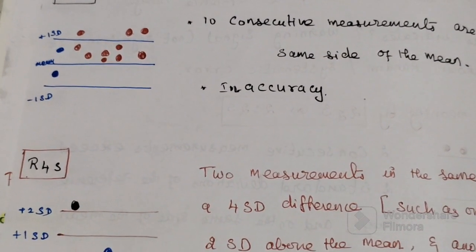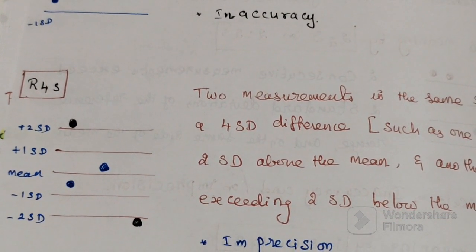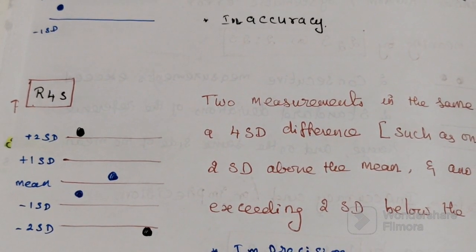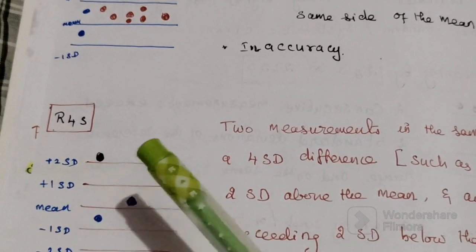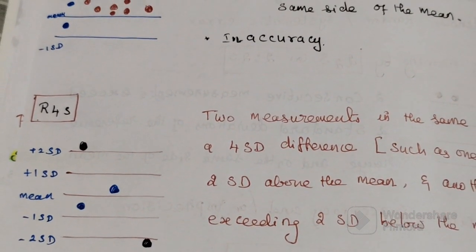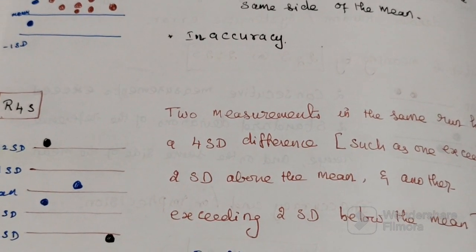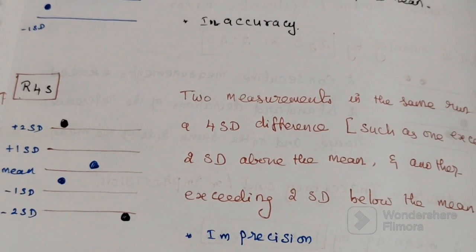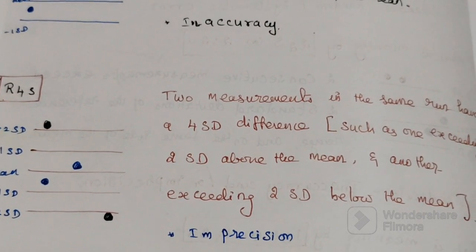Then the last one is the R4S rule. Here you can see that there are two levels of control. If one level of control is beyond 2 standard deviation, and the second level of control is also beyond 2 standard deviation, but one is on the positive side and the other is on the negative side, so the difference between both control levels in the same run is greater than or equal to 4 standard deviations, then it is called the R4S rule. Here two levels of control material have a 4 standard deviation difference between the two data points. So R4S denotes a random error.